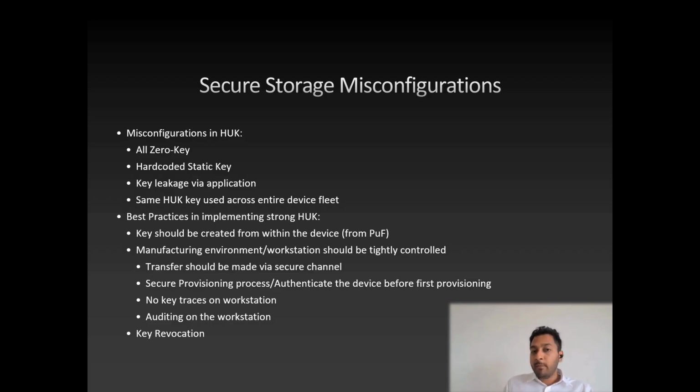Sometimes the other common misconfiguration is that the same hardware unique key is used across all the devices. So if one hardware unique key is compromised, you are putting the entire device fleet at risk.